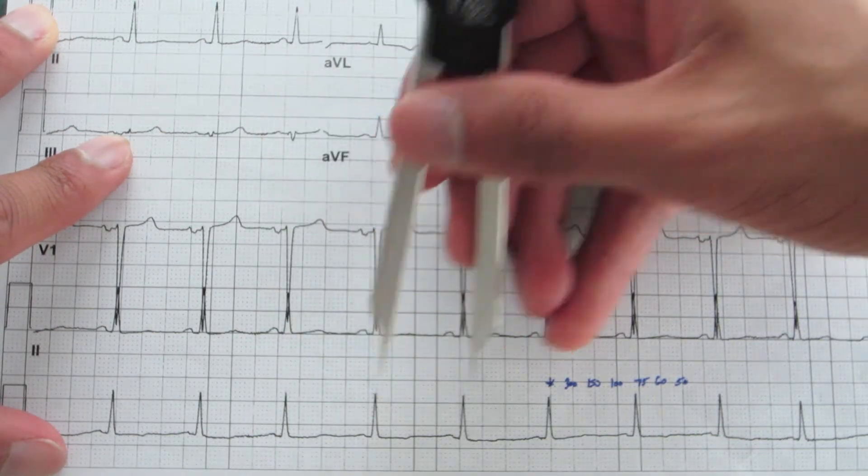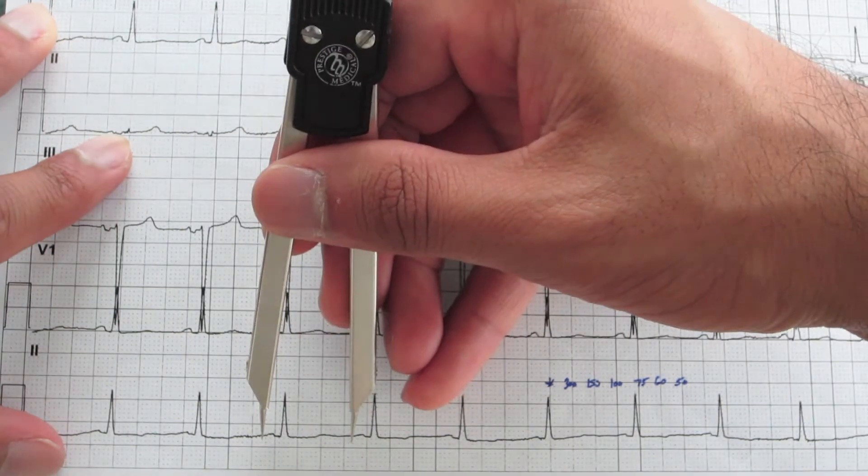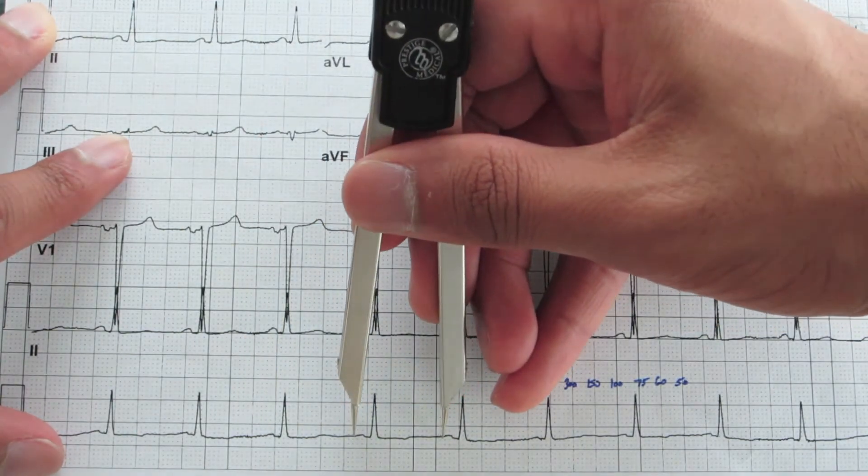Then you just make sure all the ventricular rates match up. Looks like it's walking out. Make sure the atrial rates do the same, and they all match up. So now you're ready to calculate rate. Your ventricular rate equals your atrial rate, so you only need to do it one time.